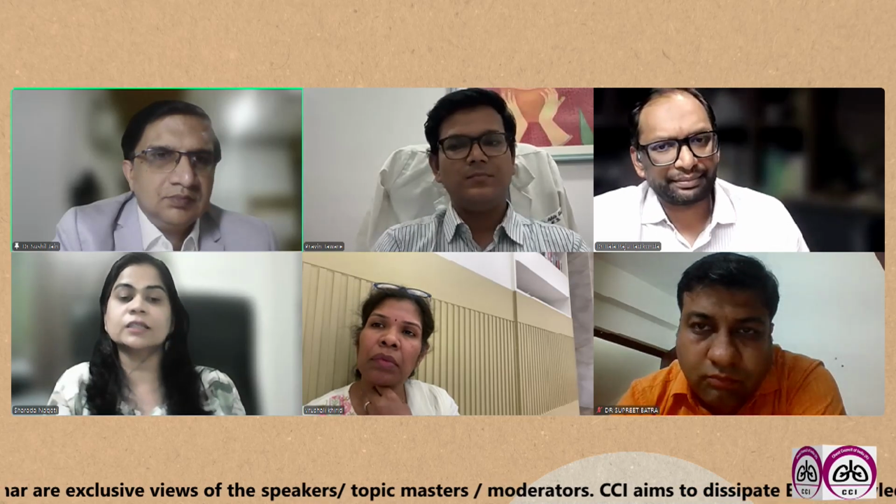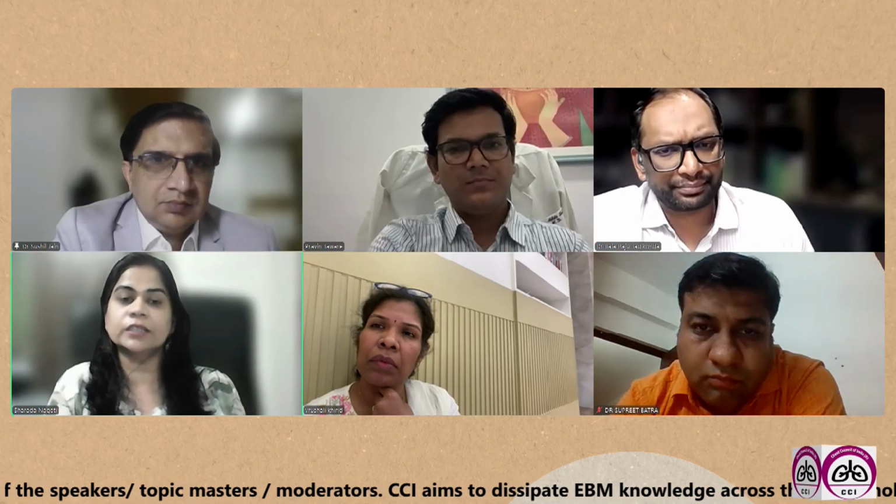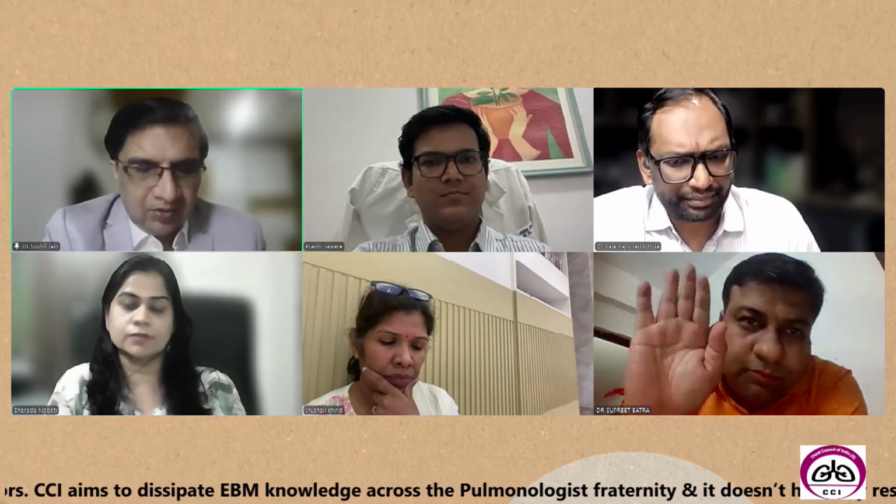Another thing is, make sure that the quantity of the fixative is adequate, so that the entire material is immersed in the fixative and is getting fixed properly. So these are the different steps that a bronchoscopist has to take. Thank you, Dr. Sharada.